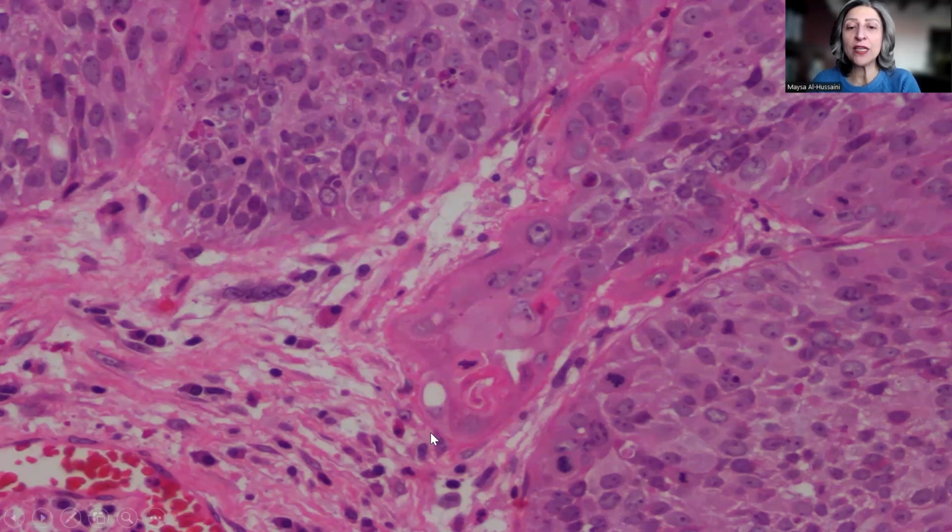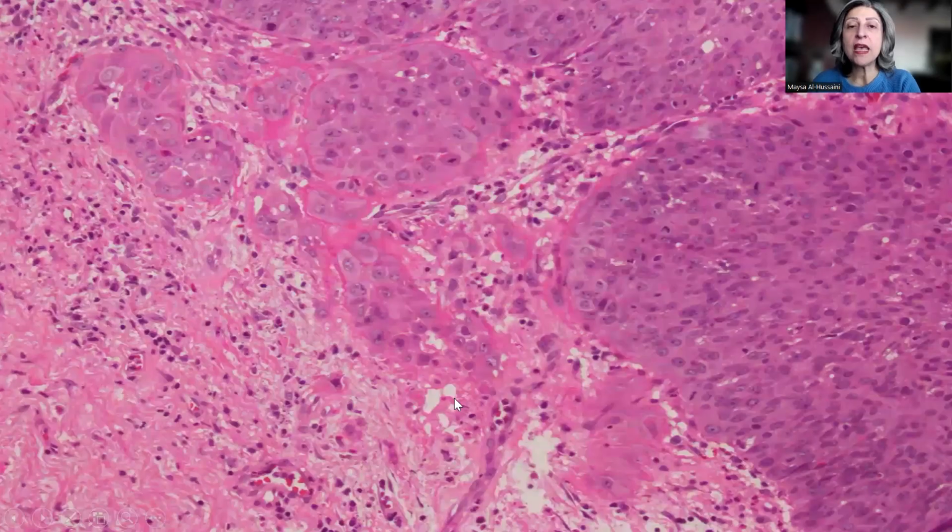And then we see here the tongue that is extending to the subepithelial tissue. And if you notice something, the cells are becoming larger with more acidophilic cytoplasm and the start of keratinization. And another focus here, very clear. So here we have the carcinoma in situ, and then we have here the tongues that are extending from the overlying carcinoma in situ into the underlying subepithelial tissue, those cells showing abundant acidophilic cytoplasm with vesicular nucleus and prominent nucleolus.